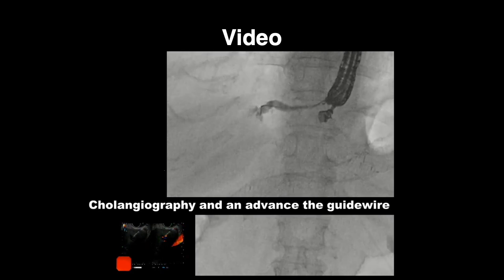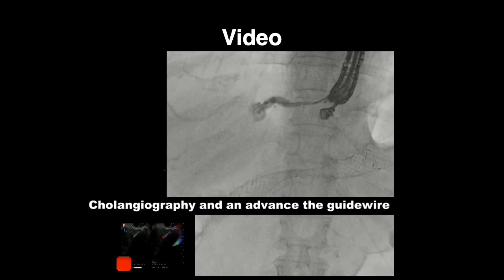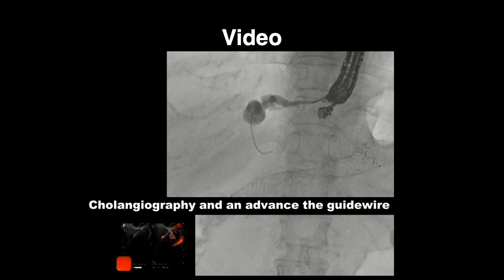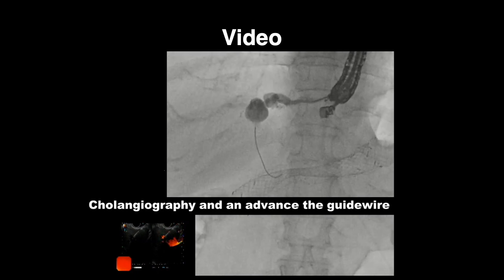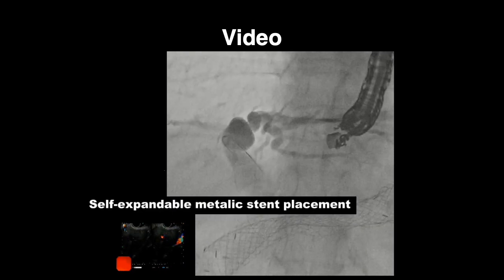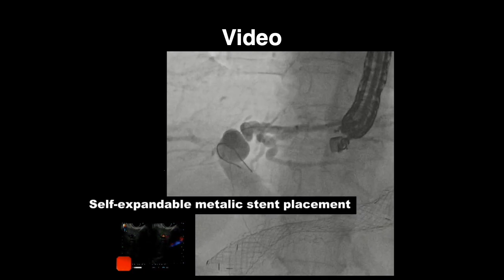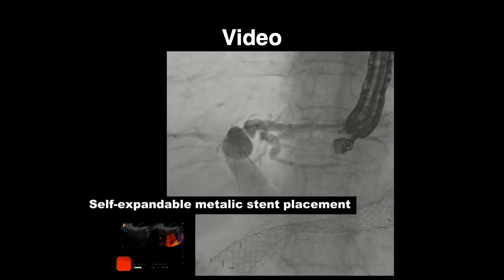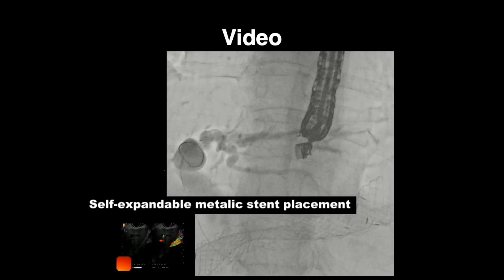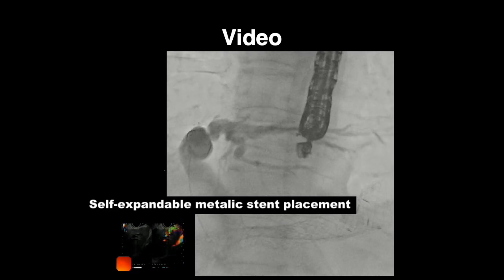Subsequently, we advanced the guide wire to the extrahepatic bile duct, and the puncture needle was removed while maintaining the guide wire. Finally, an 8 mm self-expandable metallic stent was placed directly without dilation. The procedure was completed in 19 minutes. No procedure-related adverse events were observed.